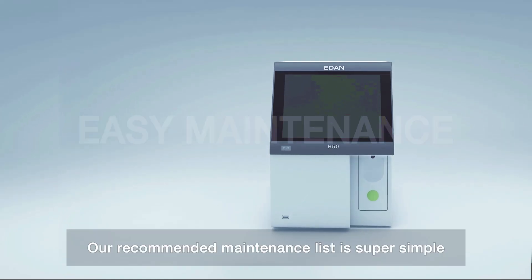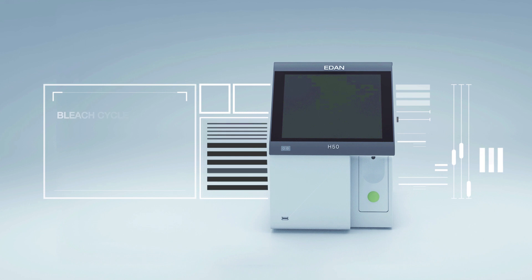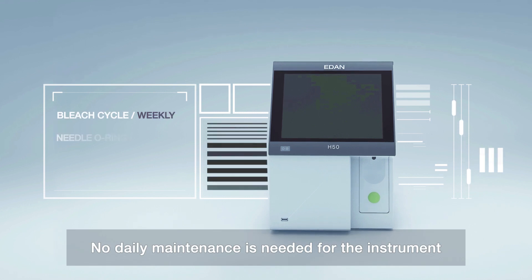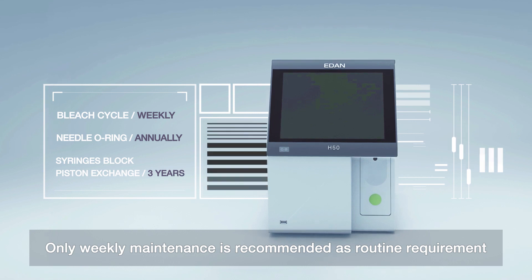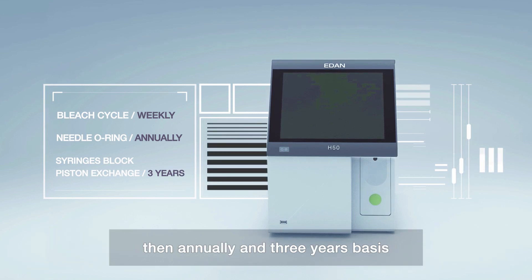Our recommended maintenance list is super simple. No daily maintenance is needed for the instrument. Only weekly maintenance is recommended as a routine requirement, then on an annual and 3-year basis.